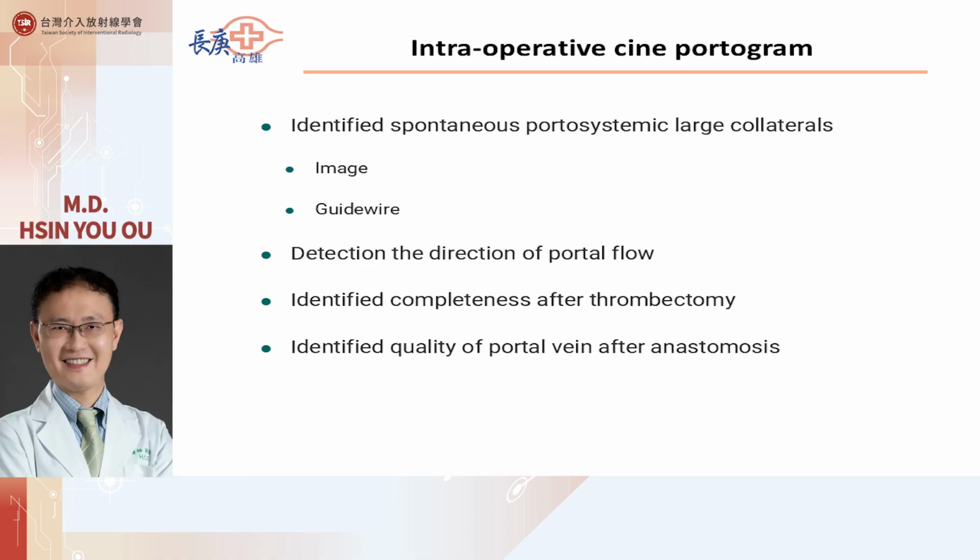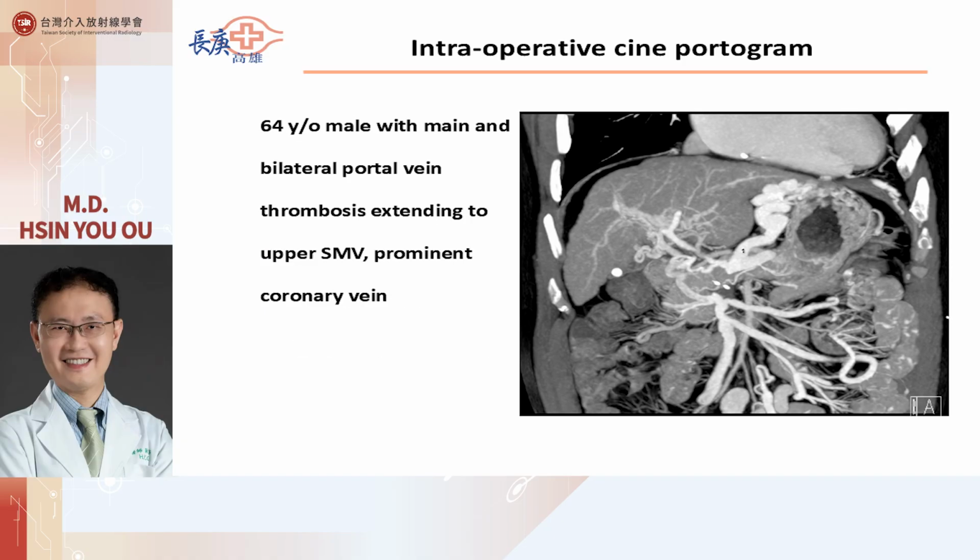Actually, we will identify the portal flow direction, because after the liver transplantation we need to keep the right direction of portal inflow, and after the thrombectomy we need to identify the quality of the portal vein. And finally, after the anastomosis, we need to identify the adequate portal inflow. So today we will show a case.